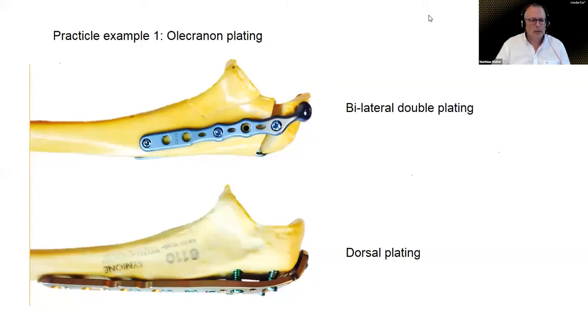There's another question there. Are there minimum specifications in Europe? I think this is something that you can answer towards the end, if this is okay, Paulina. Specifications are always the same, by the way. They're all according to ASTM. Question answered. Okay, and just coming back to this olecranon plating.